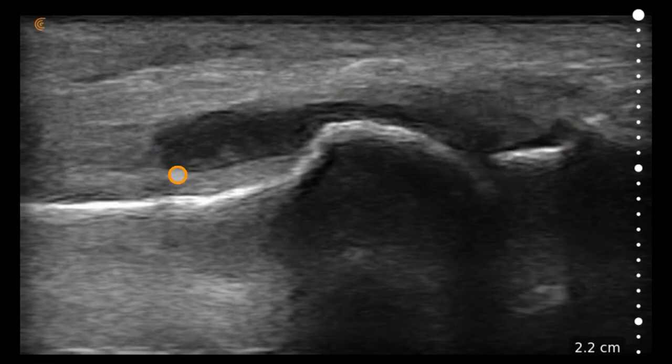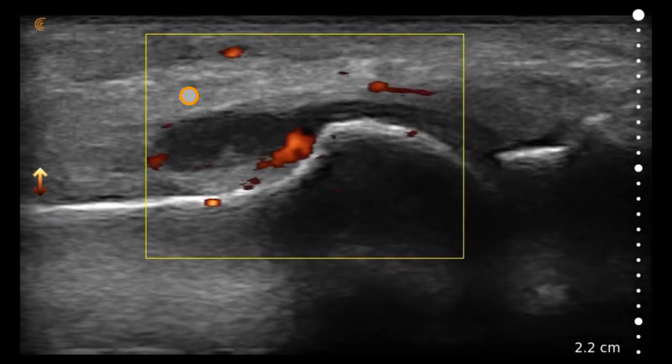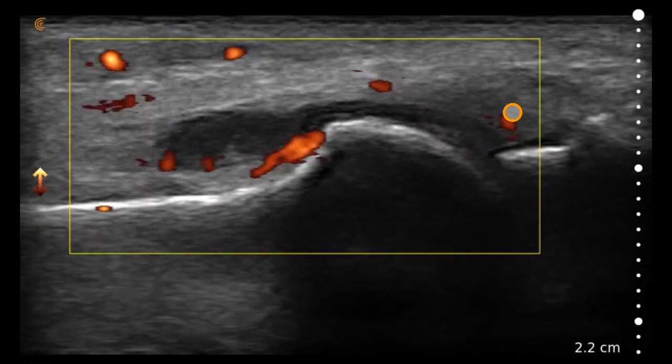we see this hypoechoic fluid collection suggesting a joint effusion. When we put on power Doppler, we can see that it is quite hyperemic, suggesting an inflammatory process here.